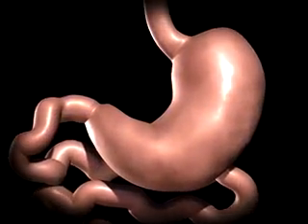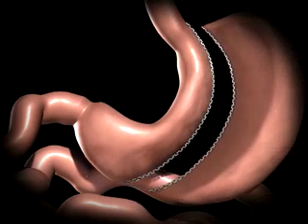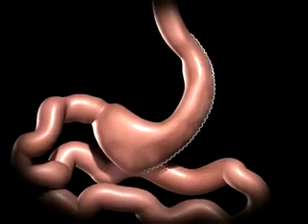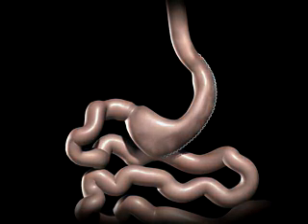During a sleeve gastrectomy, a thin vertical sleeve is created by using a stapling device. This sleeve will typically hold between 50 to 150 millilitres, which is about the size of a banana. The rest of the stomach is removed. The newly created gastric sleeve is able to hold approximately one-tenth of what the stomach was able to hold before.